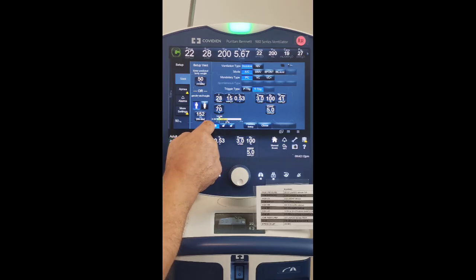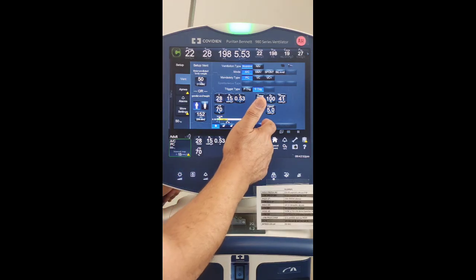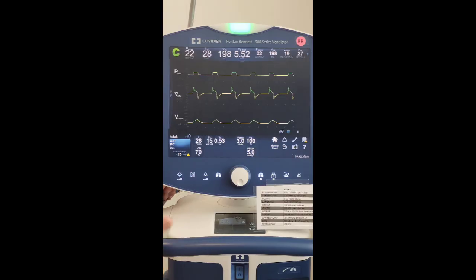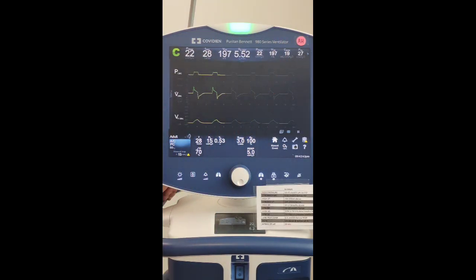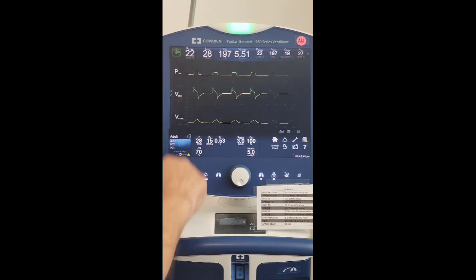The expiratory time is 1.61, and total cycle time is 2.14, which you can actually calculate. Again, 28 into 60, that'll give you your total cycle time. So we're at IE ratio of 1 to 3. Okay, so we achieved what we wanted. We set our alarms, answer the questions on the paper. Also, make note of what we had to do here to maintain minute ventilation. And so we can see that kind of went down with minute ventilation.